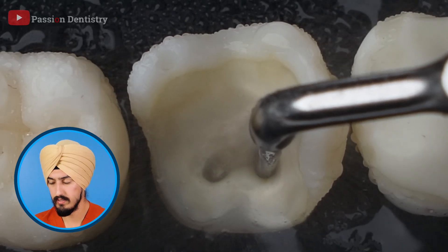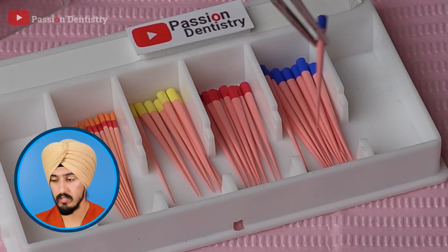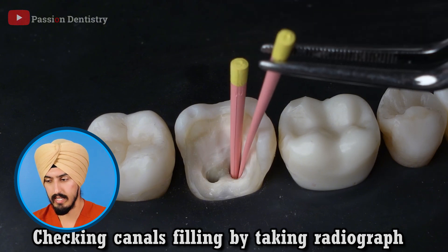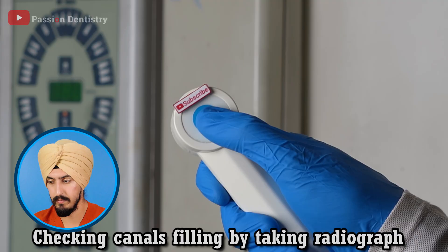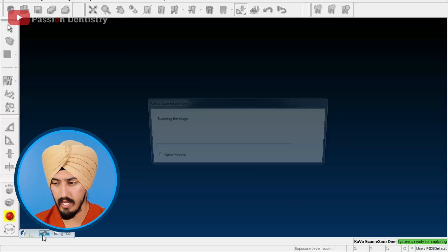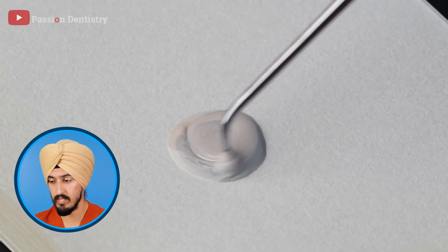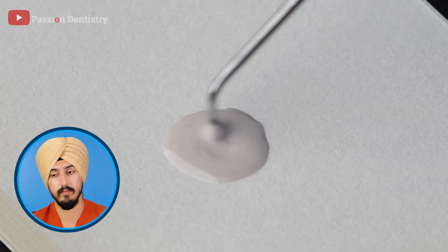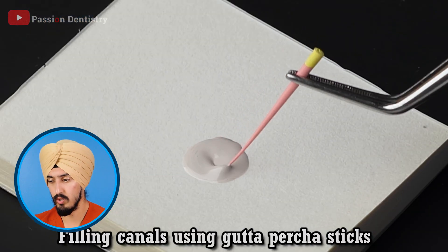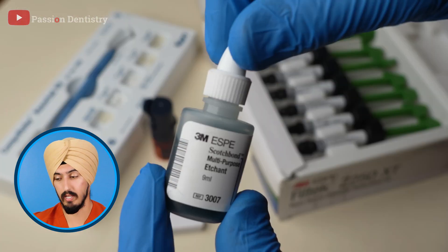Now he's cleaning out the canals a little bit more and then drying them — oh, that's a cool suction tip. These are things called gutta percha — basically rubber points that go in there and seal everything off after you're done with the root canal. Then you'll take an x-ray to check everything: make sure the lengths are good, your working lengths are good, the apex locator was accurate. If that looks good on the x-ray, we're good to go with the finish. So next thing he's going to do is put a sealer — when you put those gutta percha points you also want a sealer around them to make sure everything gets sealed off to prevent any new bacteria from getting in. It looks like he sealed off those front two canals. I'm guessing he's going to put something called a post in the back one — that's why you can't see the gutta percha on that back canal.